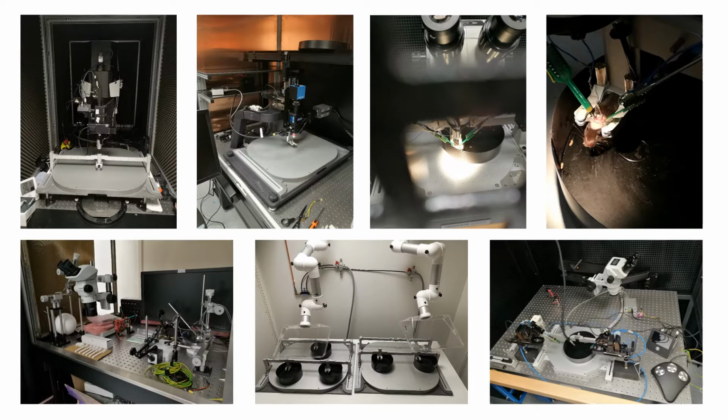And the same head fixation apparatus is used in most of these setups, which means that we can move the mouse between the setups during the same experiment, and we can compare the neuronal signaling at different scales. For example, we can start with a wide field imaging, with a cortex-wide imaging, identify the areas of interest, and then zoom in with a two-photon microscope, or even perform an electrophysiological recording in the area that was identified with the wide field imaging.